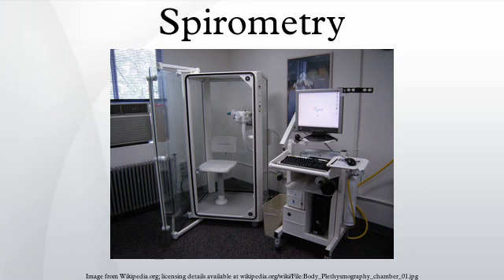Spirometry is the most common of the pulmonary function tests, measuring lung function, specifically the amount and/or speed of air that can be inhaled and exhaled. Spirometry is an important tool used for generating pneumotachographs, which are helpful in assessing conditions such as asthma, pulmonary fibrosis, cystic fibrosis, and COPD.